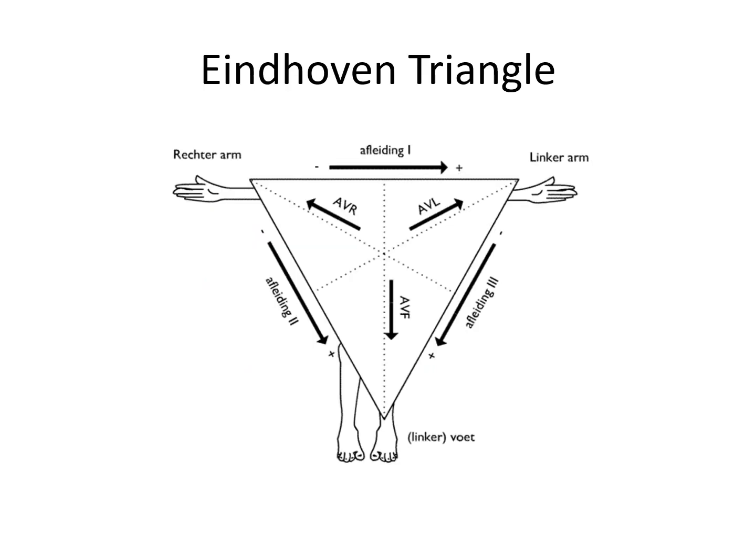Now it's time to introduce the Einthoven triangle, which I'm sure you're familiar with from medical school. Einthoven was the first electrophysiologist who connected these electrodes. They give us a view as to where the electricity in the heart is going in two dimensions, in the horizontal and the vertical plane. Just as a reminder, lead 1 will turn positive if the electricity is going towards the left. It's a purely horizontal lead. It doesn't care what's happening in the vertical plane.